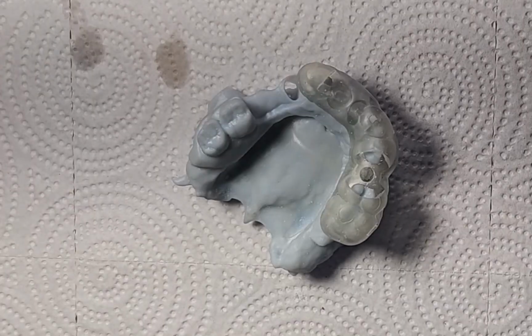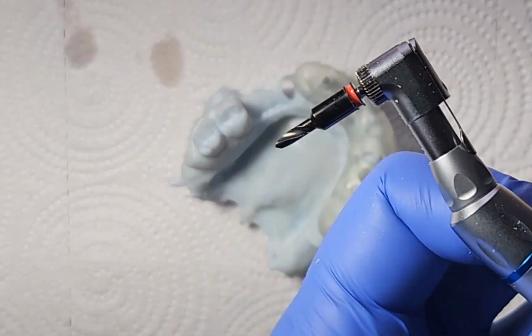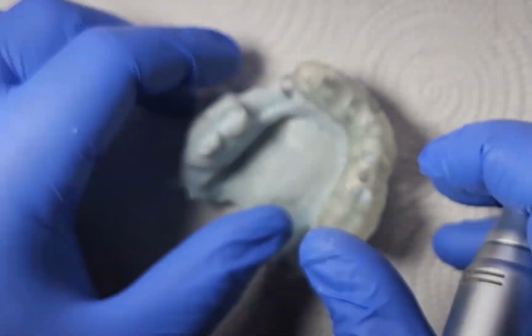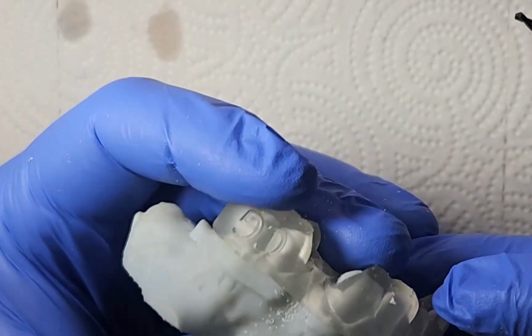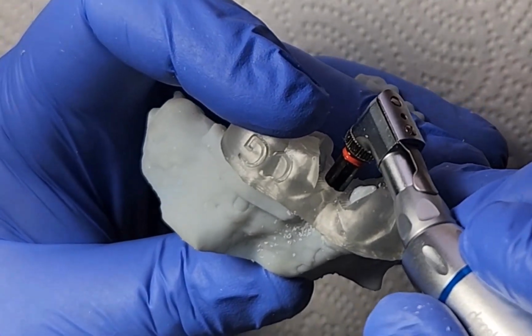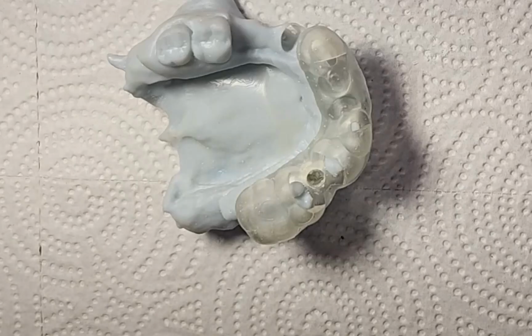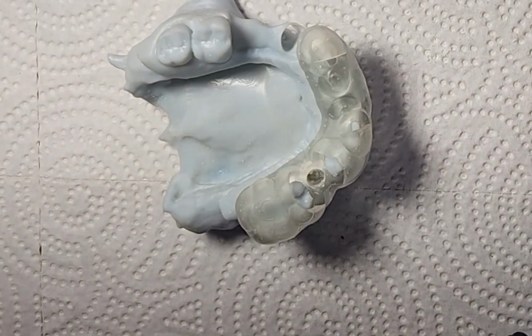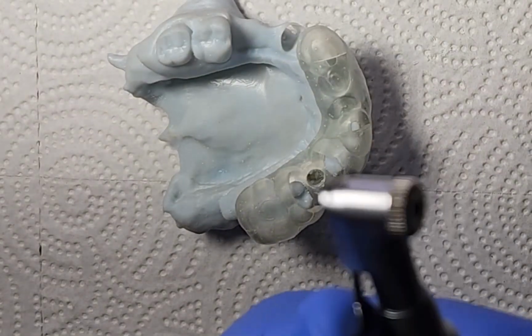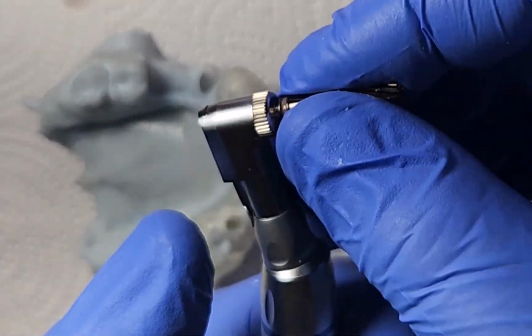And so I'll usually work my way diagonal. So if I just use 2x6, now I would go with the 2.5 by 8. All right, so a little bit up in length and a little bit up in diameter. And this should feed right into your previous hole. And it's generally not going to require a lot of effort to get down. All right, so that's 2.5 by 8, and now we are at 3.0 by 10.